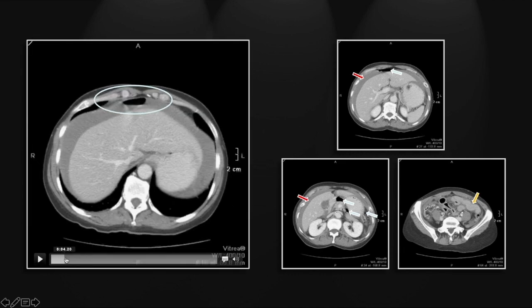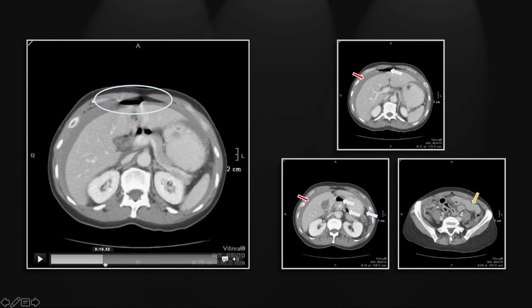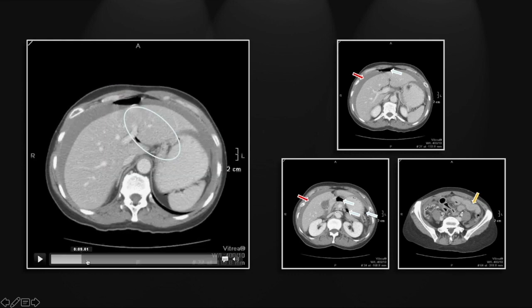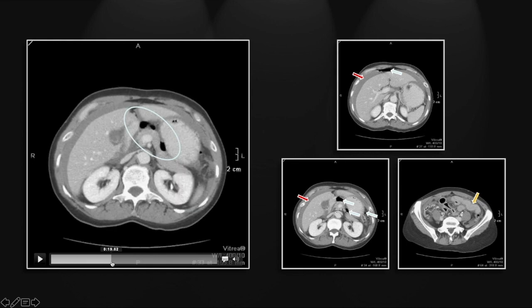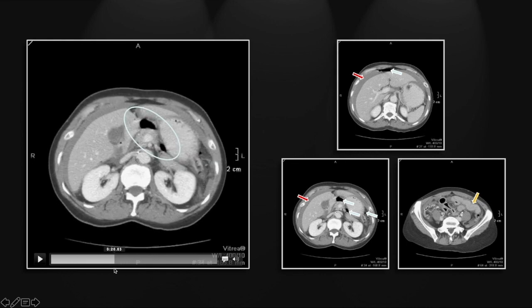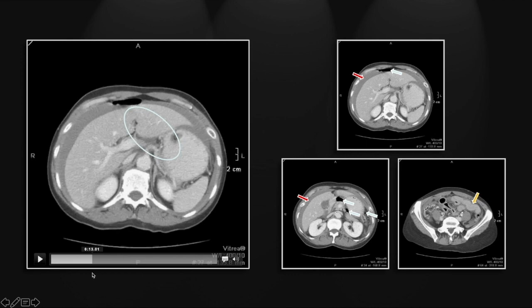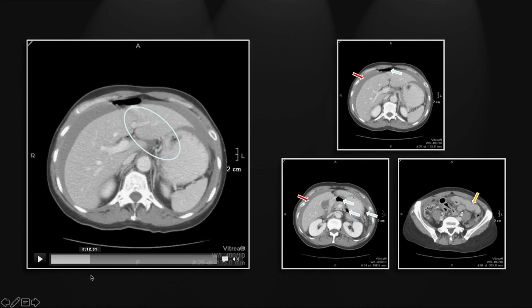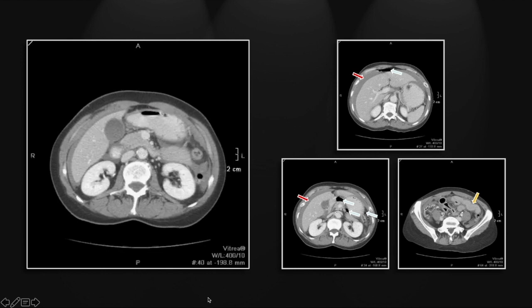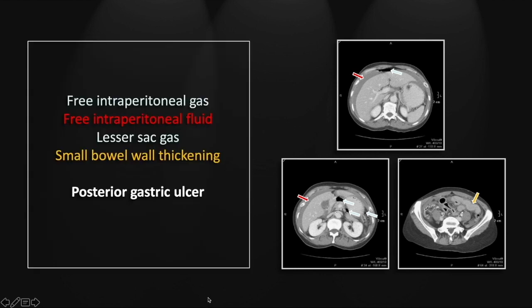Let's first appreciate that intraperitoneal gas — there it is anteriorly. And next, in the lesser sac and portal region, you can see foci of gas that are not in communication with the remainder of the peritoneal cavity. So that is a perforated posterior gastric ulcer with gas in the lesser sac.